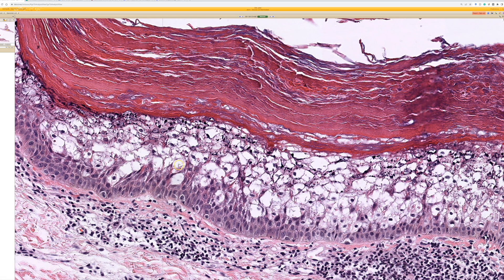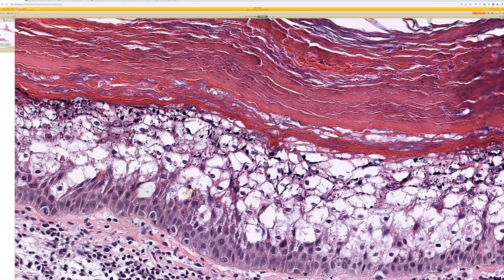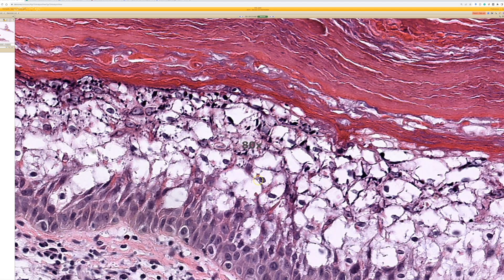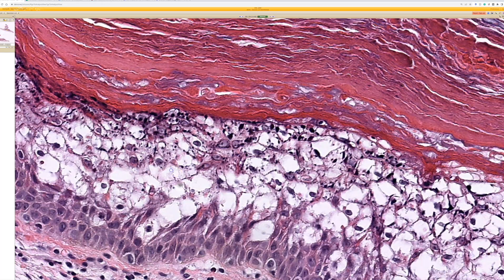It looks like the epidermis is falling apart or lysing, but it's just an artifact — it's not real. It's because the keratin filaments are tangled up instead of filling the cytoplasm, so the cytoplasm is empty and washes out. It is clear after processing, and you get globules of pink, which are misfolded keratin filaments, and globules of purple, which are big chunky keratohyalin granules.